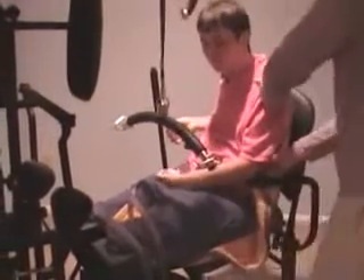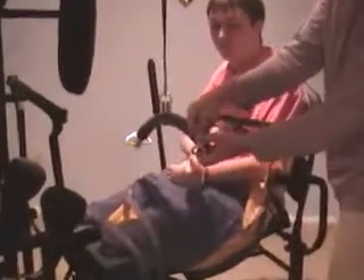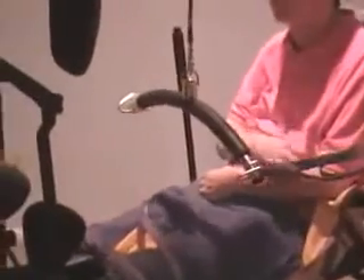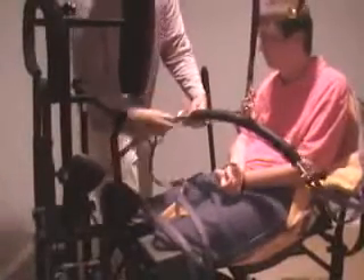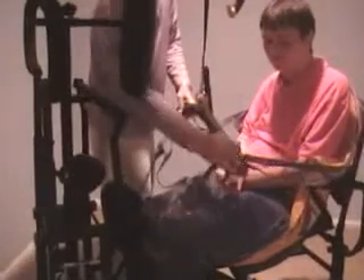Also, while in a standing position, your body has to work to pump its blood at a much faster rate because most of the blood comes to the feet because gravity takes it there. So when standing, your heart needs to pump the blood back to the rest of the body, which gives you a good circulatory workout. Another bonus is the gliding function which works to provide great stretches and movement below your level of injury. This creates a neurological signal that travels up the spinal cord through your level of injury into the brain.